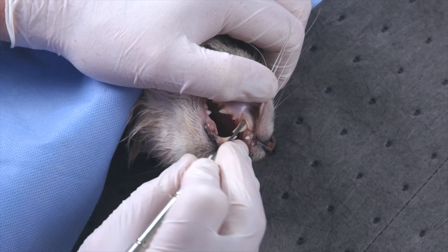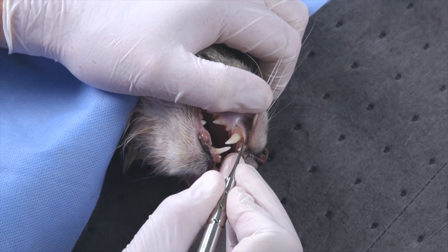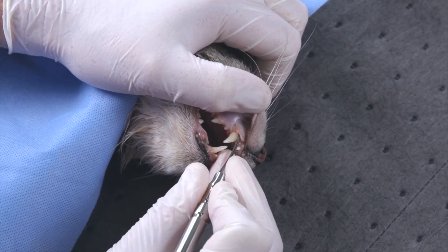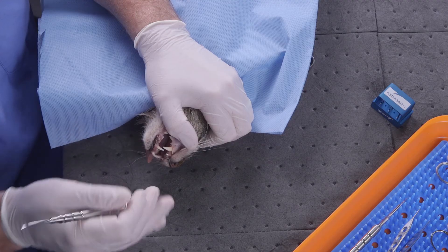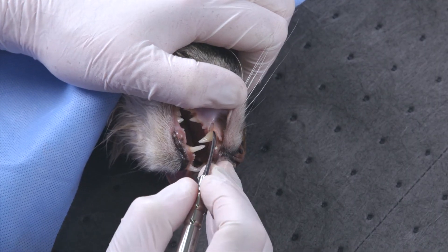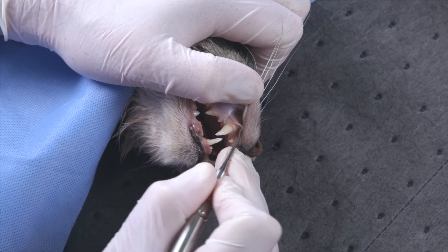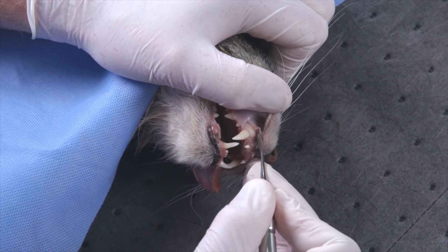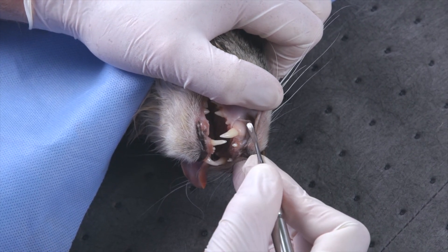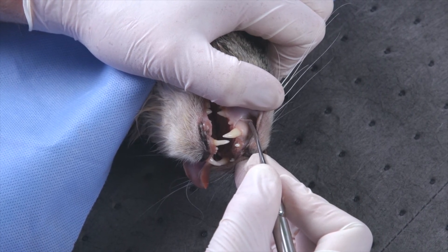Once the flap is peeled away, we can begin to see the alveolar crest, and we want to make sure the elevation continues beyond the mucogingival junction. I'll use the larger size of the Syndex periosteal elevator to be more efficient with the remaining elevation of the soft tissues away from the bone, making sure I elevate beyond the mucogingival junction to expose the bone that I want to use the high-speed drill to remove in aiding the extraction of this tooth.